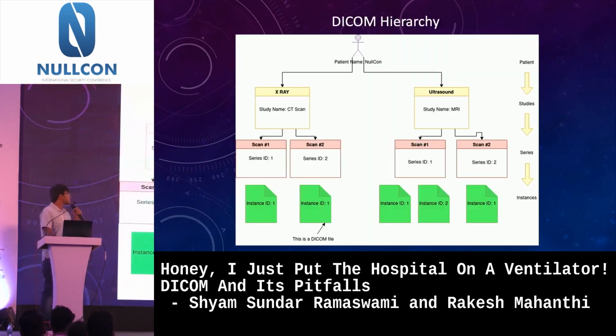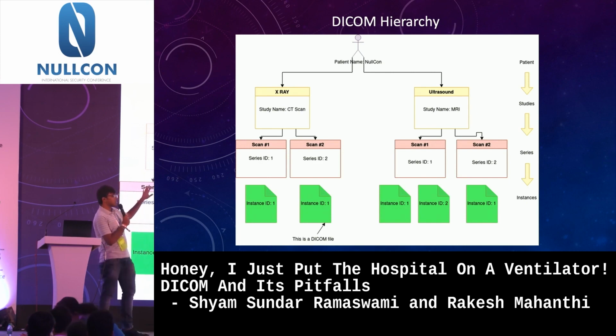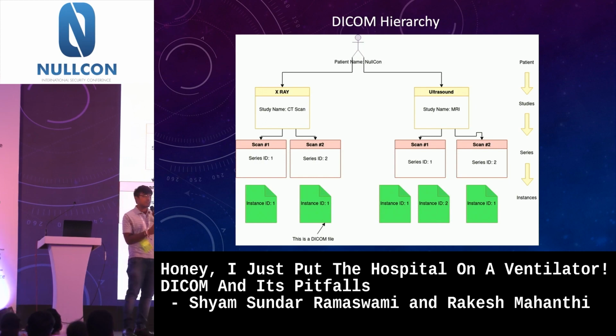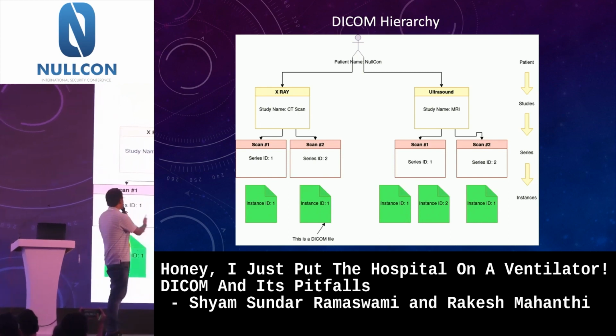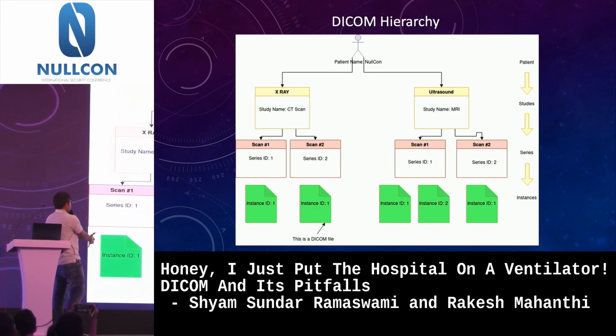So moving ahead, do you guys know what exactly happens when you go to a hospital and go through a scan or a procedure? So let's say there is a patient called Nullcon. He went to a hospital and the doctor has suggested he go for an X-ray and an ultrasound scan. So these two scan types are called studies in the medical terminology.